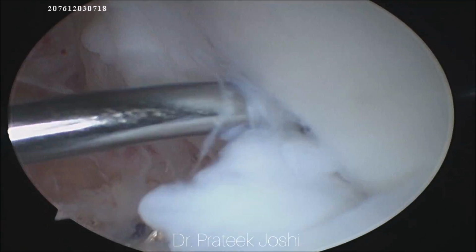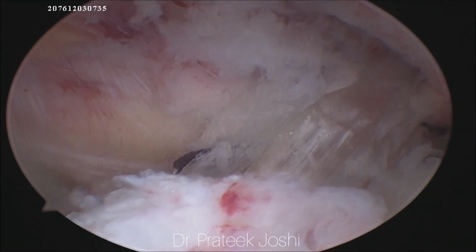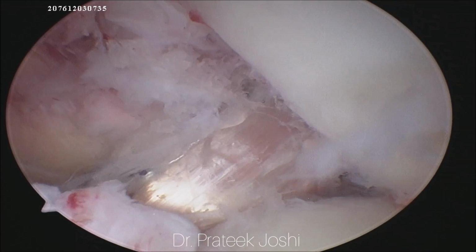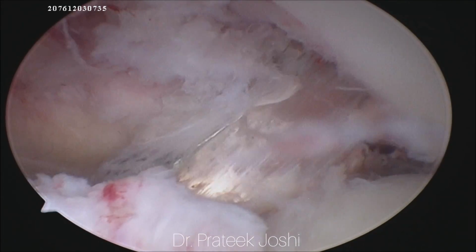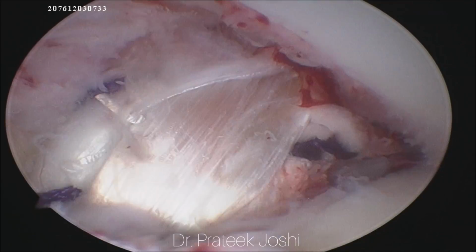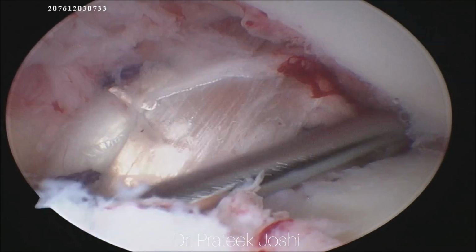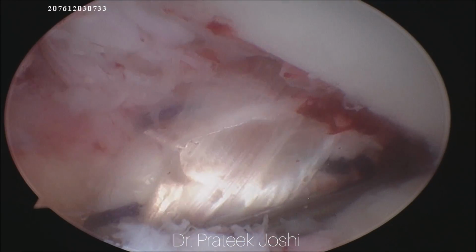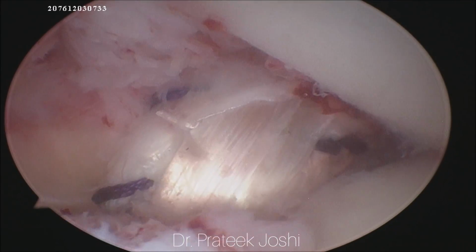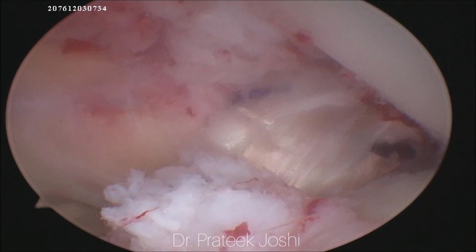So now the full length of the femoral tunnel is being occupied by the new ACL graft. The length of the graft which is in the femoral tunnel is 20 millimeter. Now we are going to do cyclic loading of the ACL graft and then fix the graft at the tibial end with interference screw of 9 into 25 millimeter, and this is the final picture of our ACL graft after tibial interference screw fixation. You can see that the position of our graft is anatomical and it is quite robust in nature.